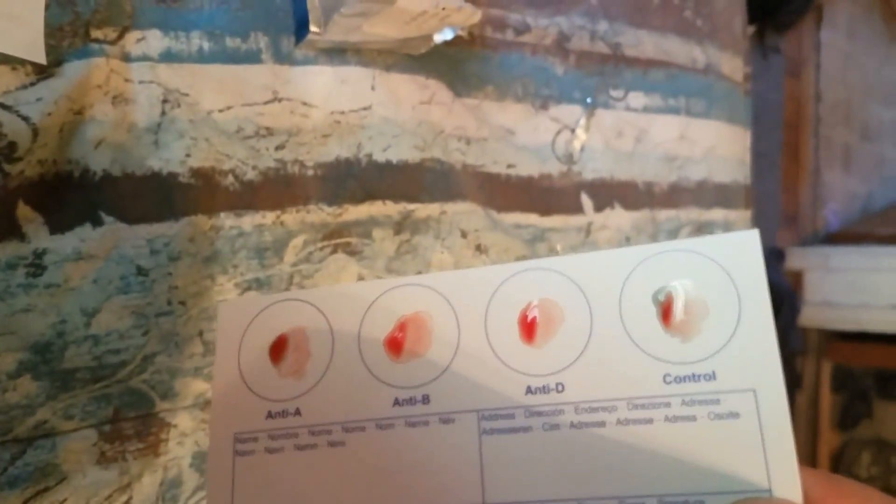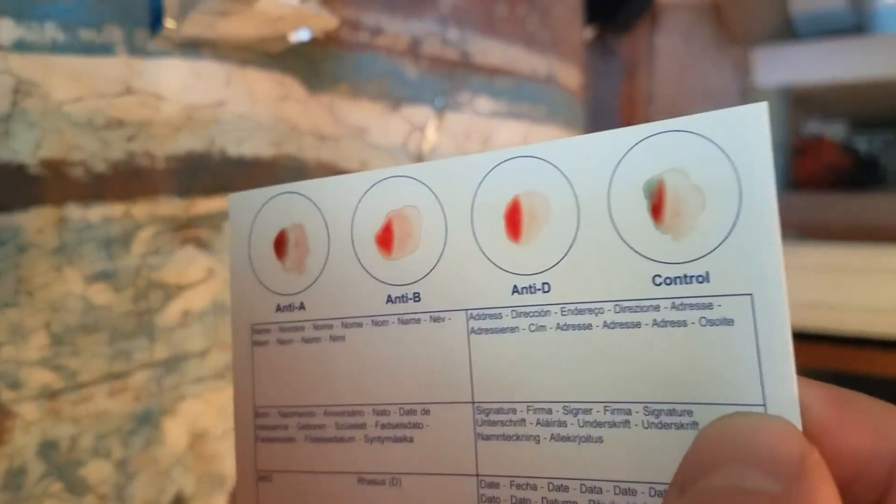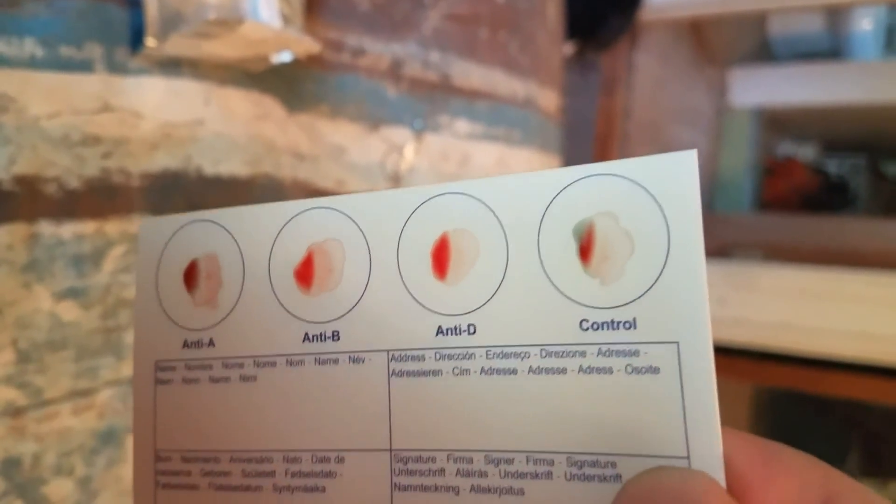Now I hold each stick in the drop for ten seconds — one, two, three, four, five, six, seven, eight, nine, ten — and repeat that for each of the four drops on the card.